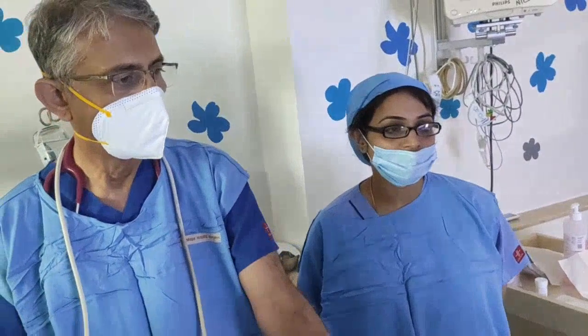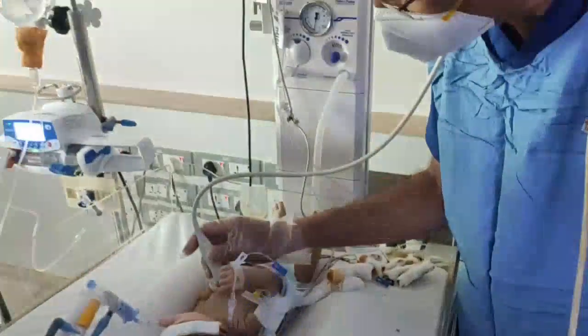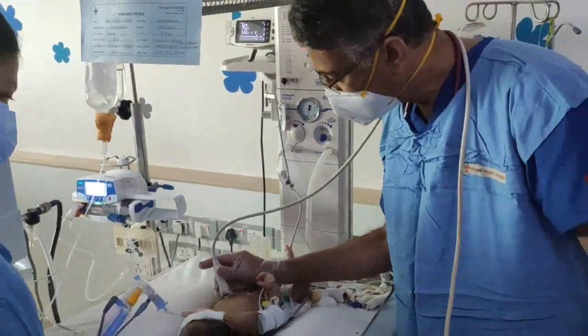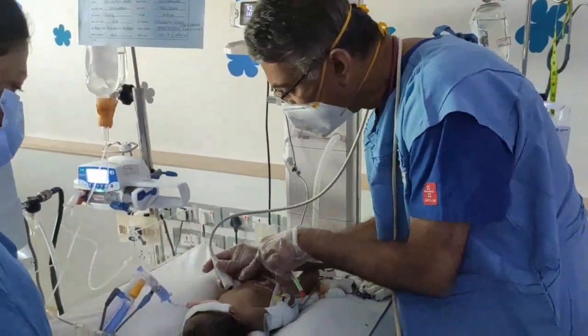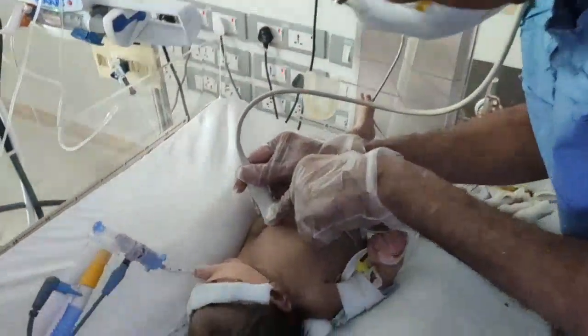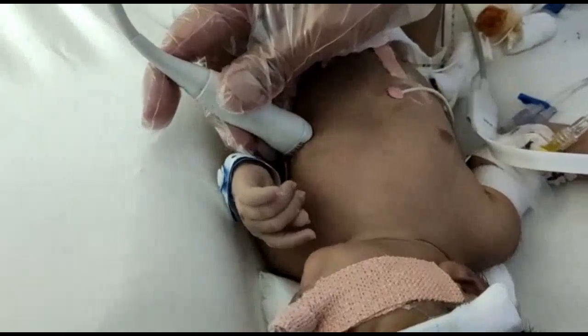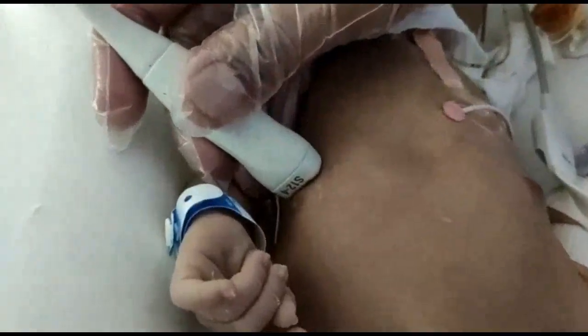Echo features of transposition of great vessels on 5-chamber view. How to keep the probe? First, this is called the 4-chamber plane. This is also called the apical plane. So in this, the 4-chamber view you first take and tilt it. See, when I tilt, the 5-chamber is obtained.